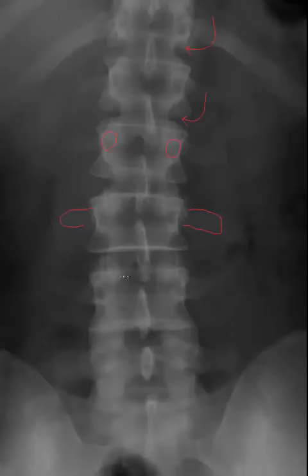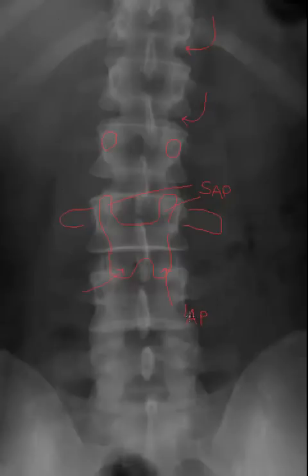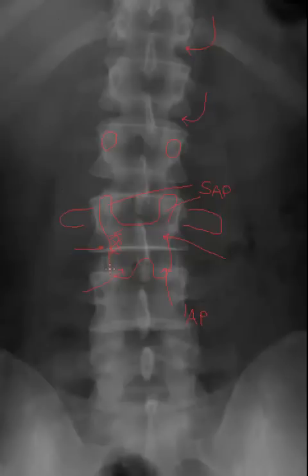Let's move on to the posterior arch. The posterior arch in the lumbar spine is seen very well — let me draw it out and identify each structure. These portions are the superior articular processes, which have an articular surface to make the facet joint. These are the inferior articular processes, which articulate with the segment below. The region between the articular processes is called the pars interarticularis. This region is important because findings here may lead to patient symptomatology, and we'll discuss it further in the oblique tutorial since the pars is best seen on oblique projections.